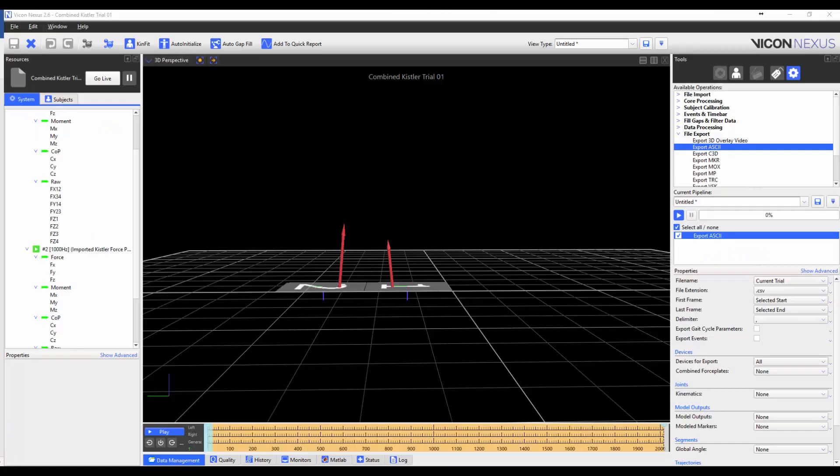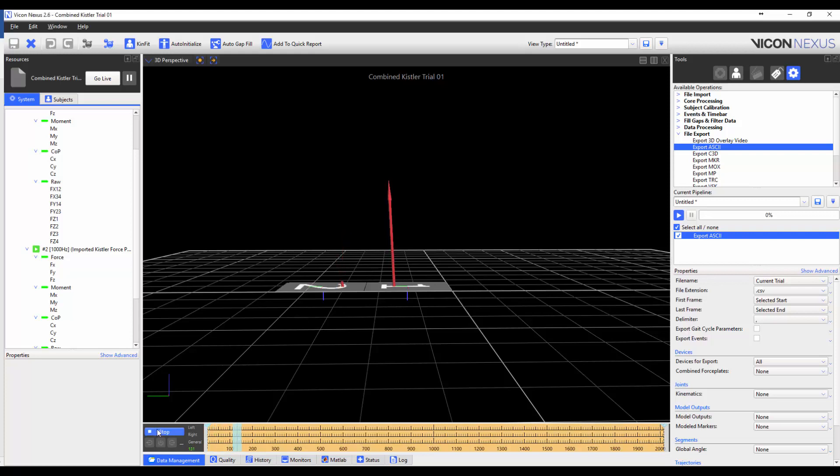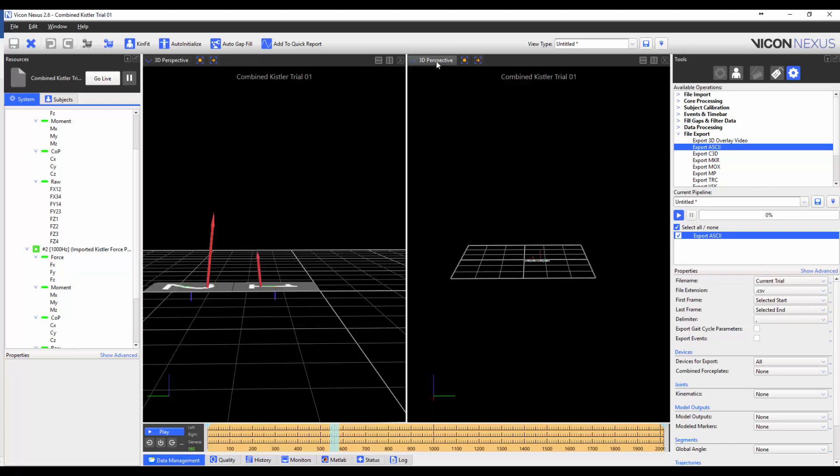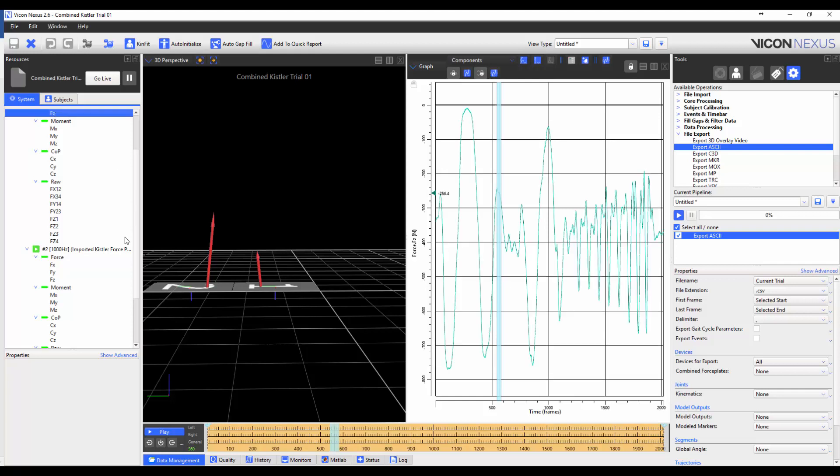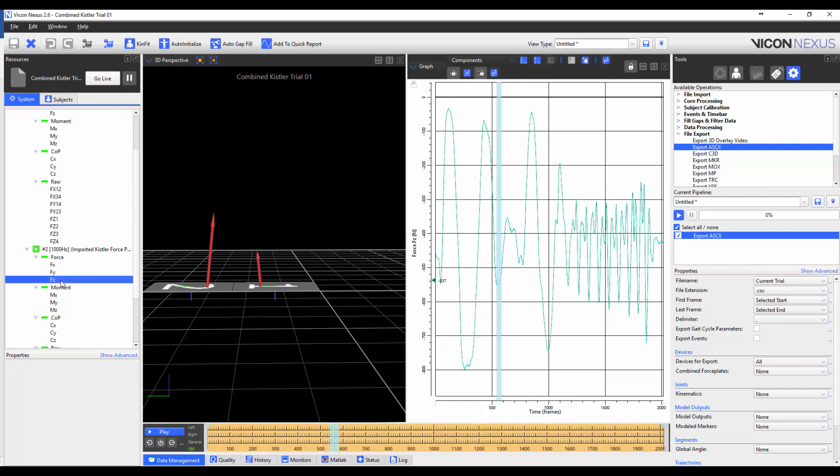We can now combine selected outputs from multiple force plates, both in live mode and with the trial loaded. In this example, I have a subject standing on two force plates, and they are shifting their weight between the two plates. We can plot the FZ component of each plate individually, and together.